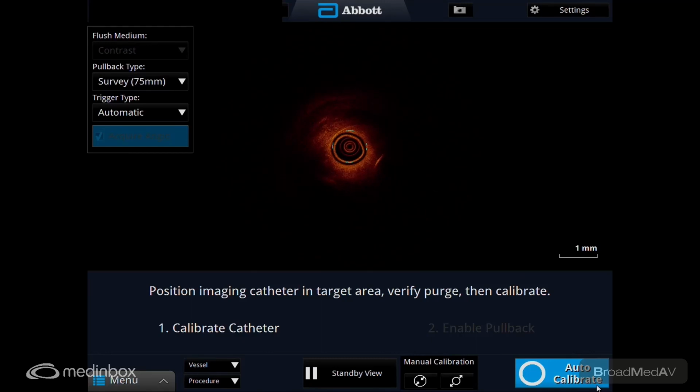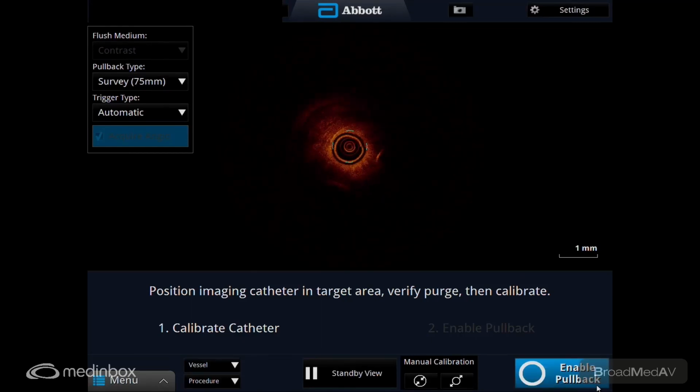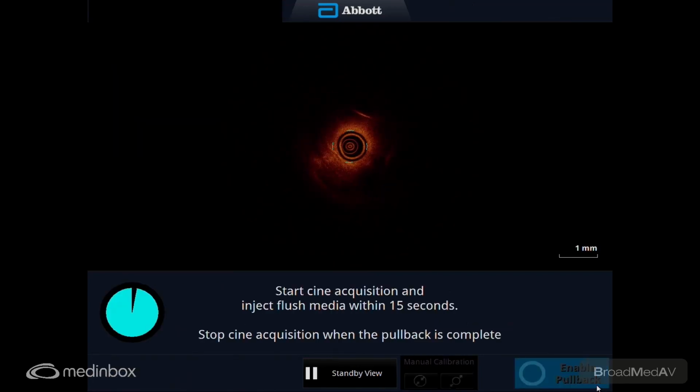Let's do another run there. Okay. Let me get the guider in there if you don't mind, Amir. There you go. Perfect. Ready? Okay, let's do it. Let's go. Let's enable. All right. Ready? Yeah.